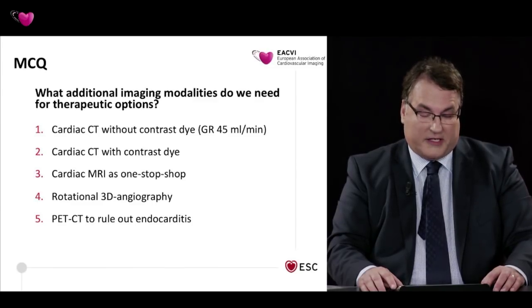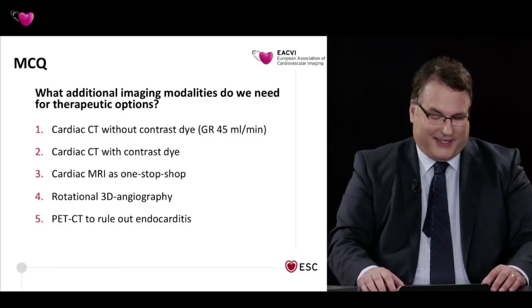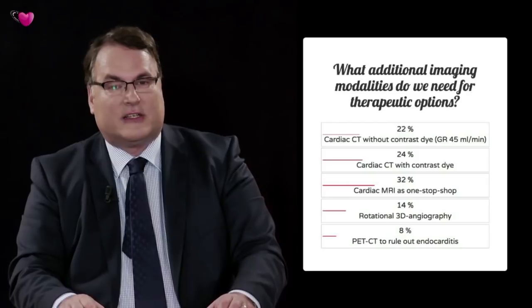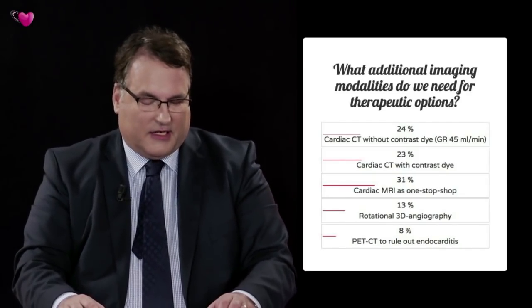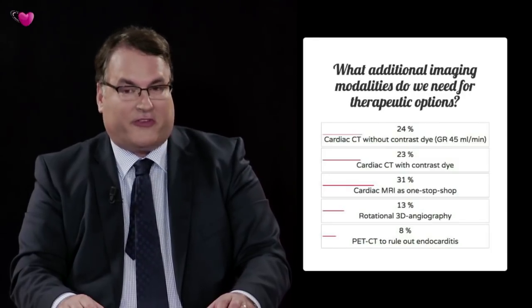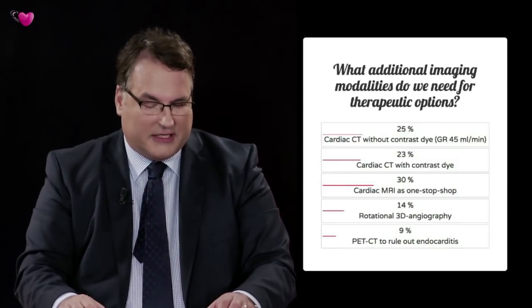It's a quite distributed answer. To start with the lowest percentage, this of course is PET-CT with a little less than 9%. Rotational 3D angiography was voted for in 13%.